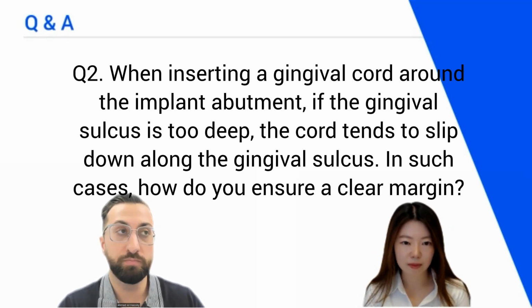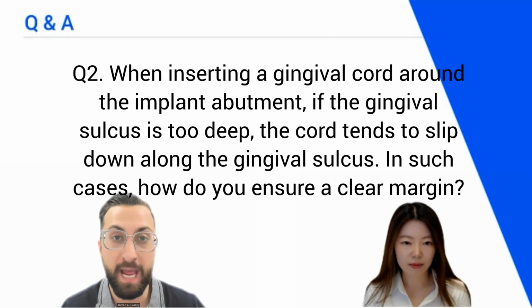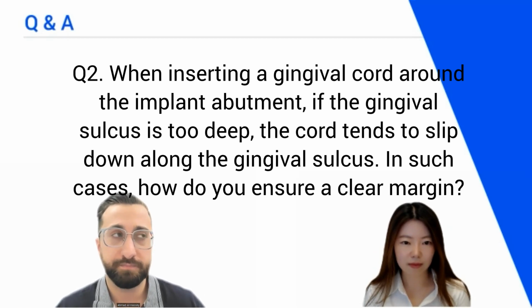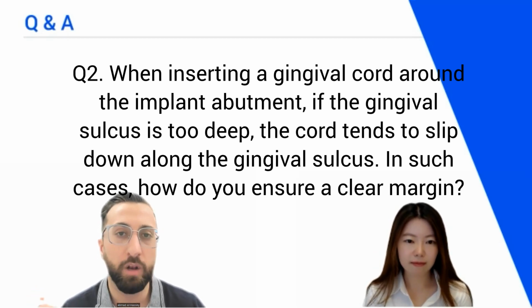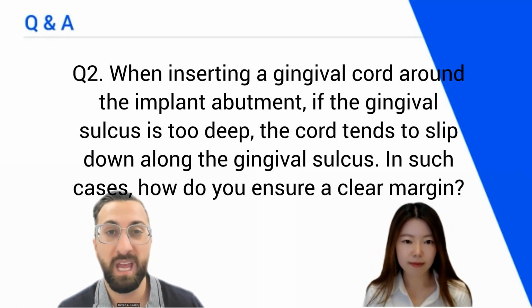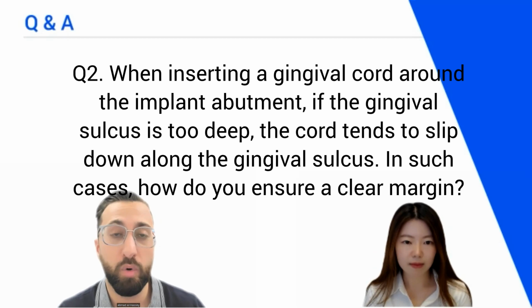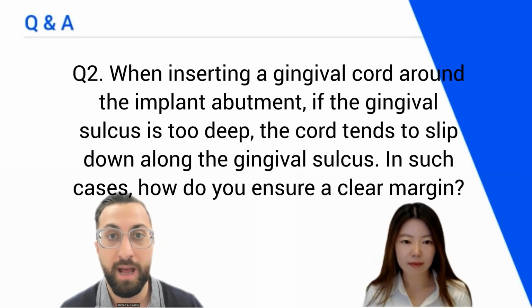If I was you and the implant abutment is quite subgingival, I wouldn't even be that confident or comfortable packing cord down there, because as many of you know, with an implant, there are no connective tissue fibers directly attached to the implant. So if you are packing a lot of cord, you really risk damaging the soft tissue hemidesmosome connection, and furthermore, putting bacteria around the implant. So I would be very cautious with packing cord around any implant.